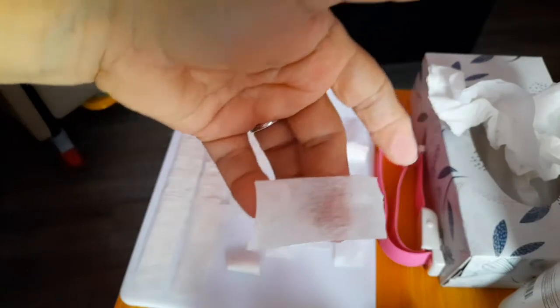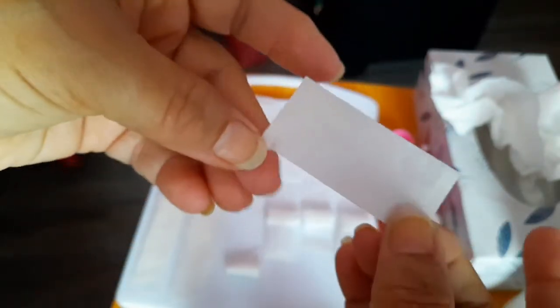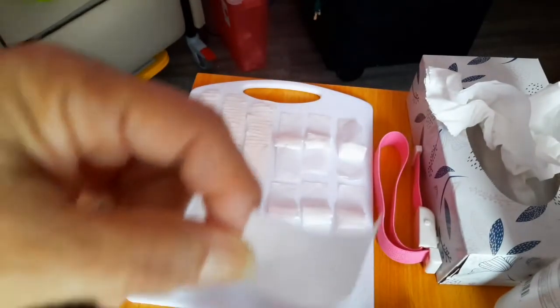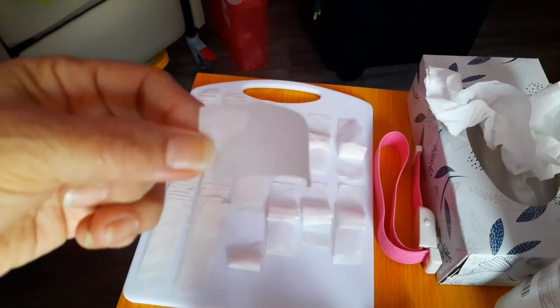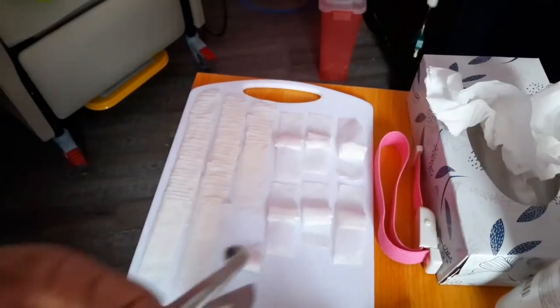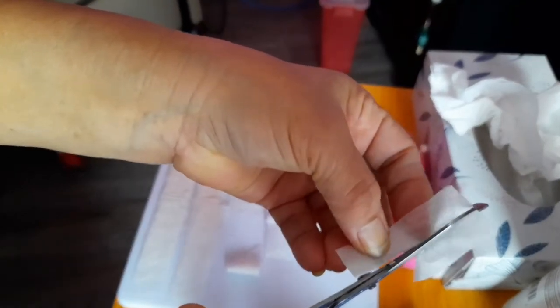Alright, so we're going to take another strip, not as long as the other one. It's about that long, I guess 2.5 inches or so, maybe 3, I don't know. But this is going to be for your wings. So here's what I do, because the wings are kind of small, they're not that wide. I like to make 2 of these, and then take the scissors and cut it right along the center. So let me go ahead and do that, and I'll show you. Okay, so you take the tape, and just in the center, slice all the way up.